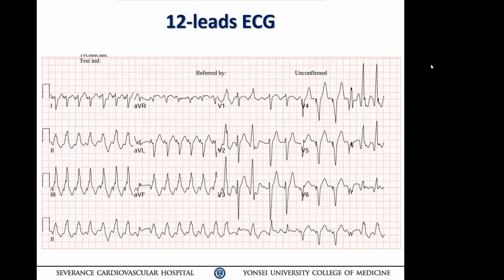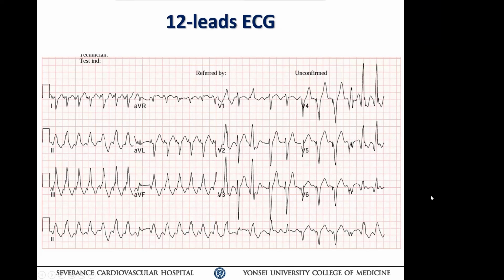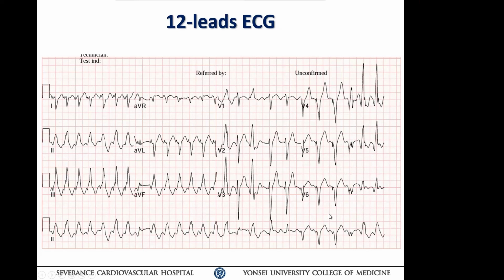Next slide. I think we can see the P wave at the last 6 beats. There's a P wave and the paced QRS. There are 3 beats, right? Yes. Can you follow the mouse? You need to find the rhythm strip. Last, yeah. Okay, so I think that there's a P wave followed by a paced QRS.